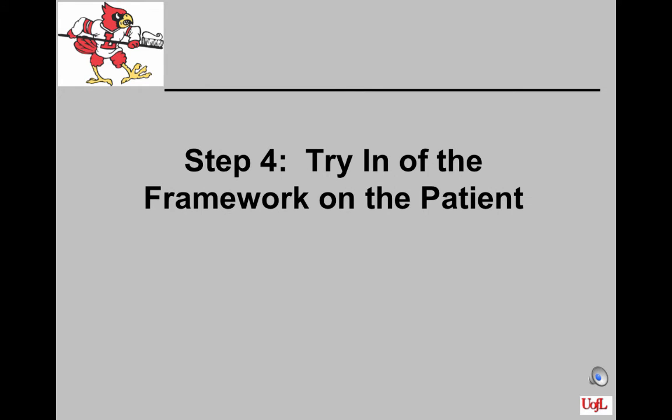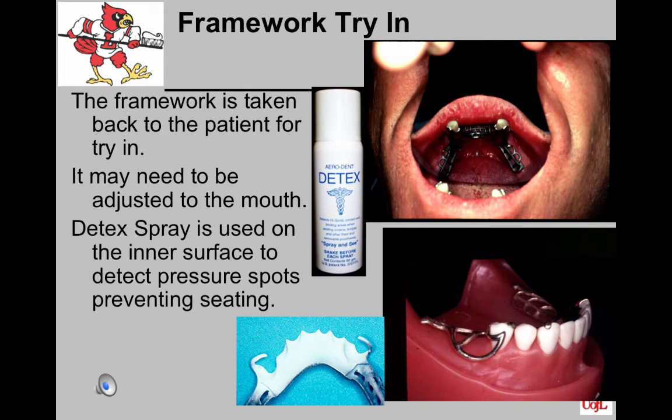We are now ready for step 4, which is trying the framework in the patient's mouth. The framework is then taken back to the patient for try-in. It must fit the patient the same as it does on the master cast. It may need to be adjusted slightly so that the components fit the patient accurately. Detex spray is used on the inner surface of the framework to detect pressure spots preventing seating.